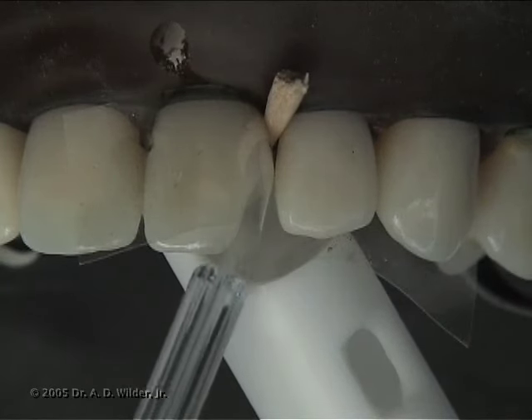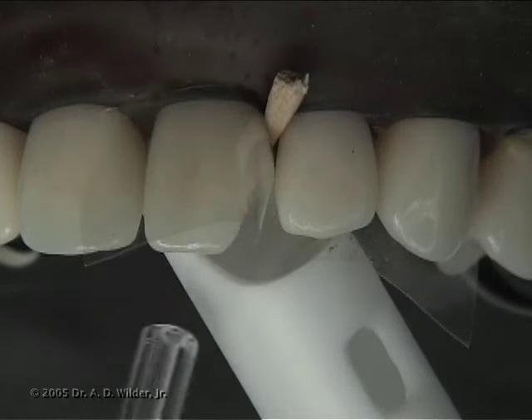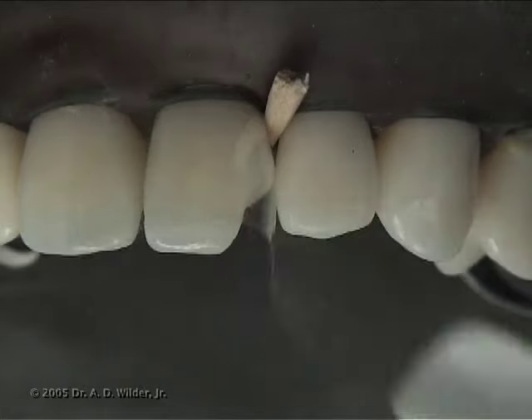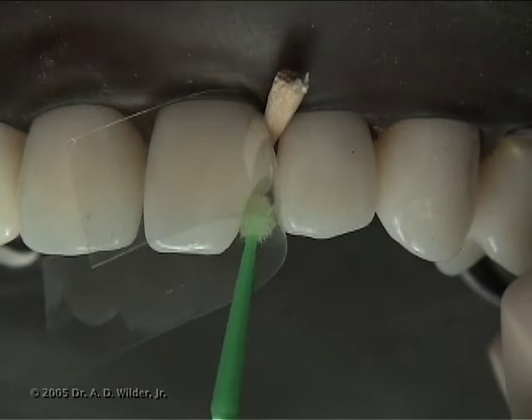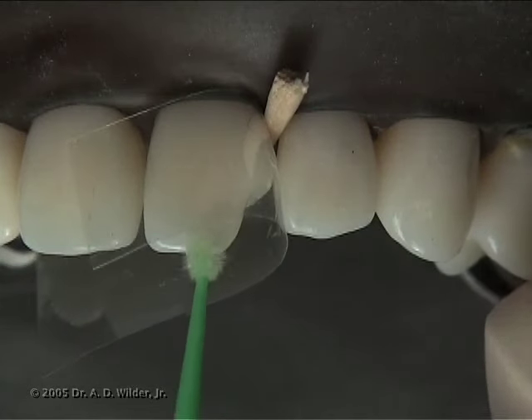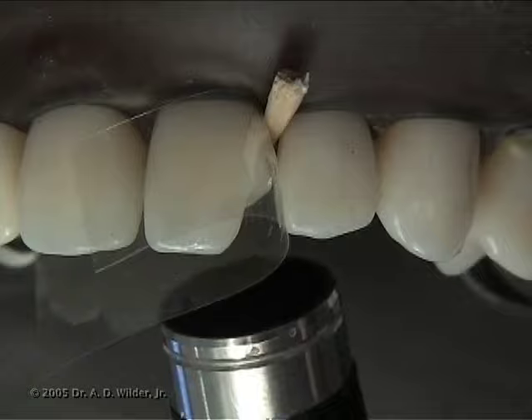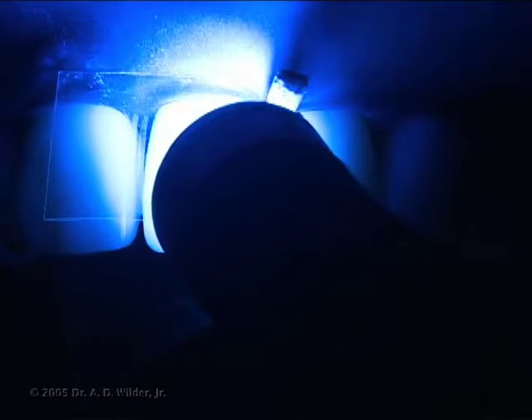Dry off the matrix and gently dry the tooth, but leave it somewhat moist so you don't collapse the dentin collagen fibrils. Apply and scrub prime and bond adhesive with a micro brush to all walls and floors of your preparation, including the beveled enamel. Gently air thin the bond to evaporate the solvent and then cure for about 10 seconds.